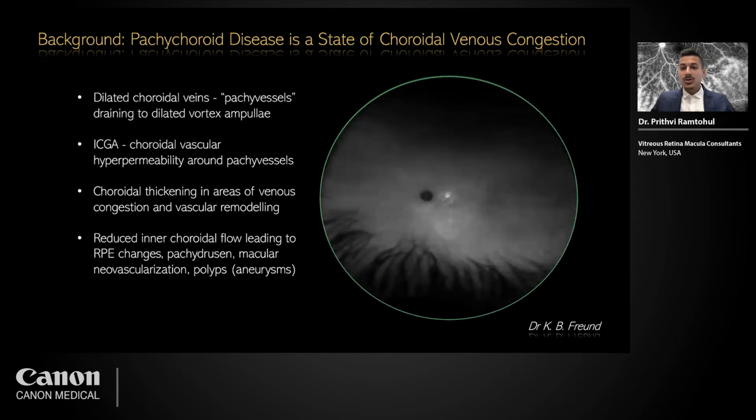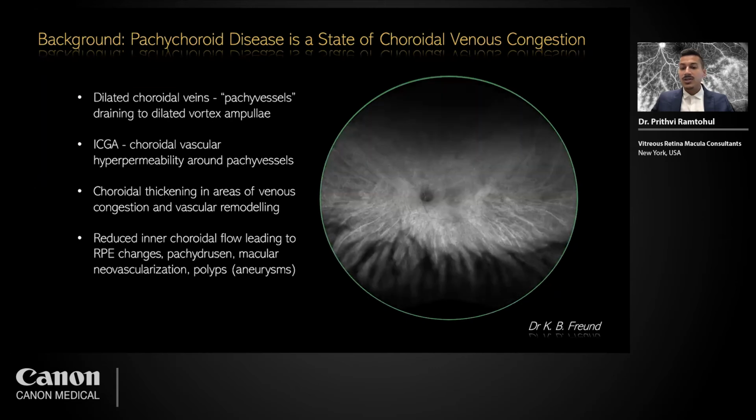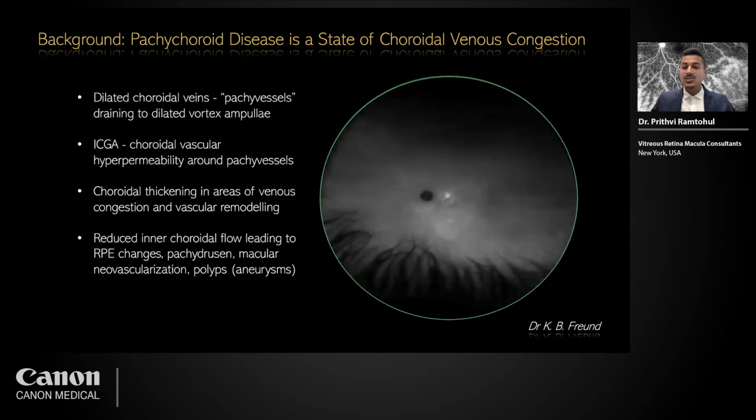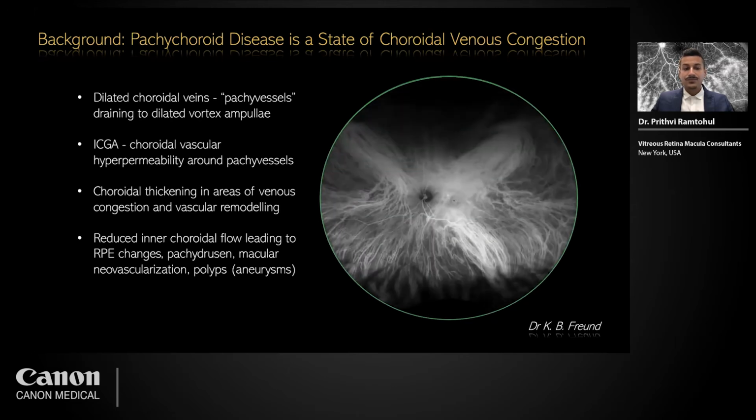And these changes result in reduced flow in the inner choroid and choriocapillaris and subsequent complications such as RPE changes, pachydrusen, and macular neovascularization.